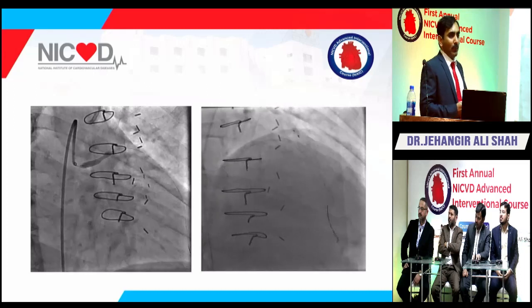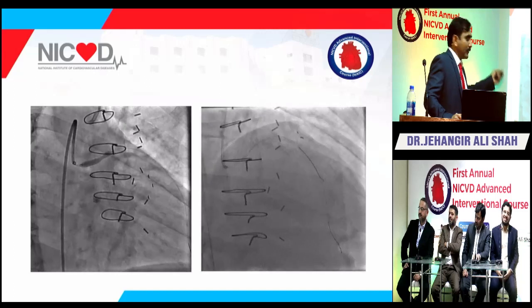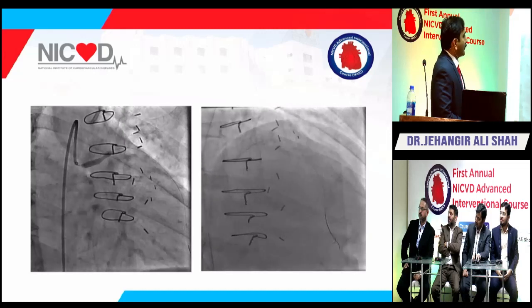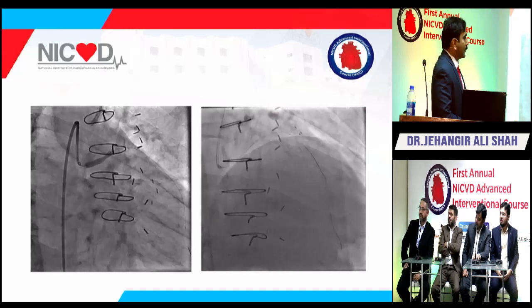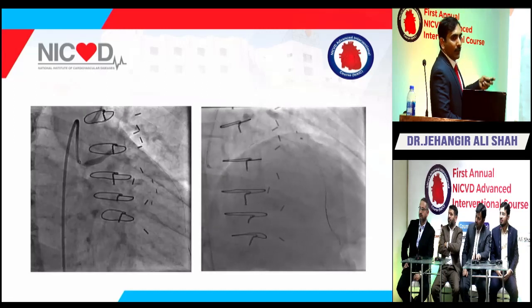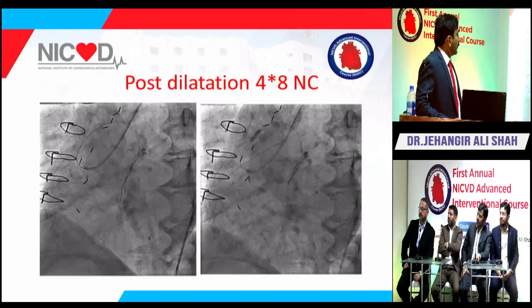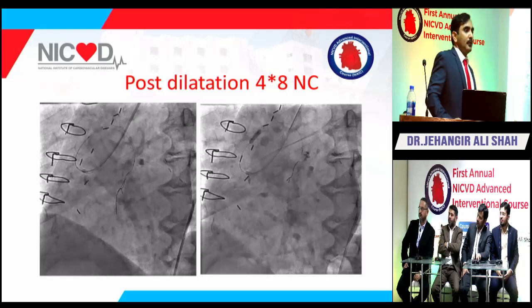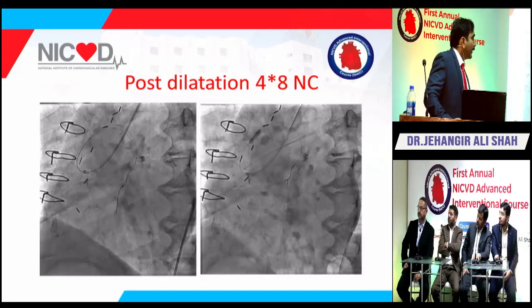While pulling back the balloon, I just lost my guider and wire, and I lost the access. So again, I crossed one wire, and at that time I took another wire and confirmed whether my wire was going through the struts or not. I confirmed it with the smaller 2.0 by 15 balloon. It was easily crossing through the stent. So I decided to take a 4.0 by 8 NC balloon and inflated at 18-20 atmospheres only at the site of the under-expanded segment and in flaring of the ostium.